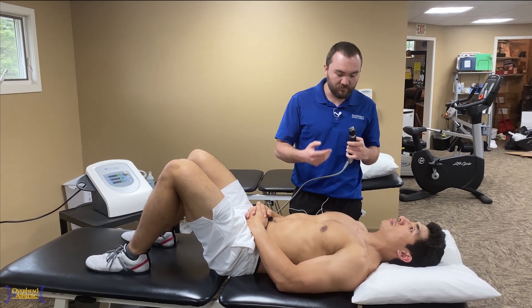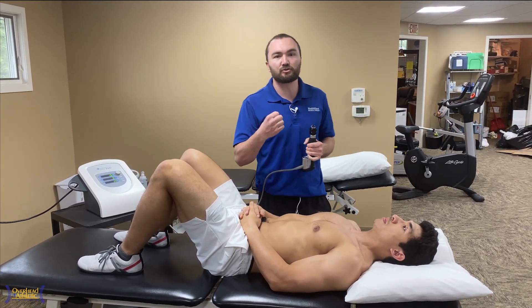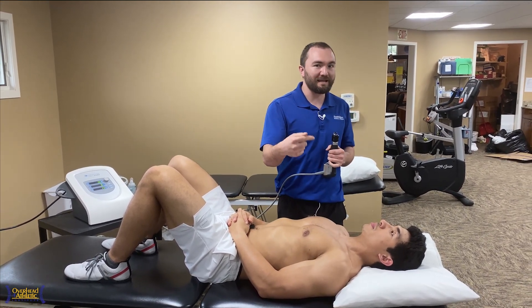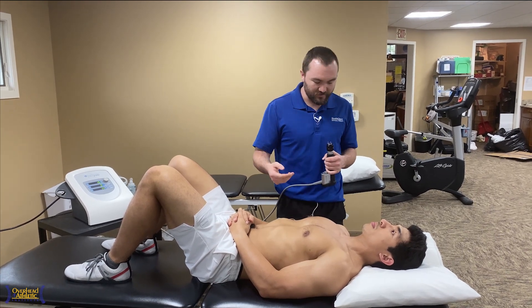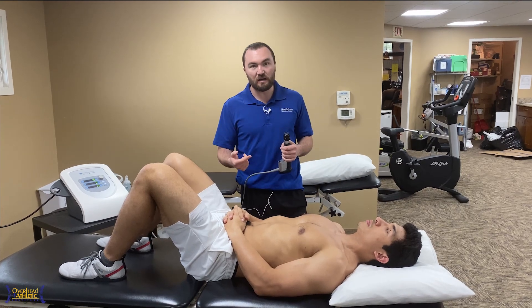Something that often becomes problematic in our throwing athletes — the most important thing being obviously to get the shoulder strong and stable. After that, make sure the throwing mechanics are where they need to be. One thing we can do besides soft tissue mobilization and those sorts of things to get athletes back to throwing a little quicker is some shockwave therapy.